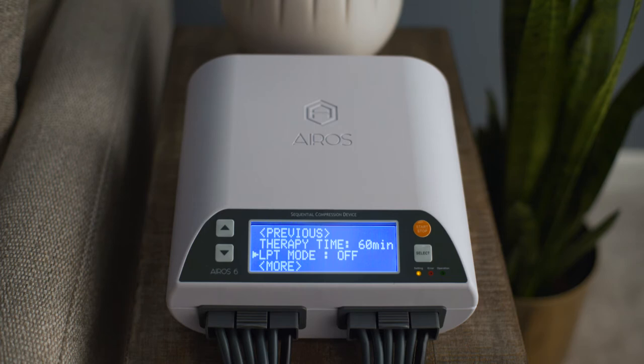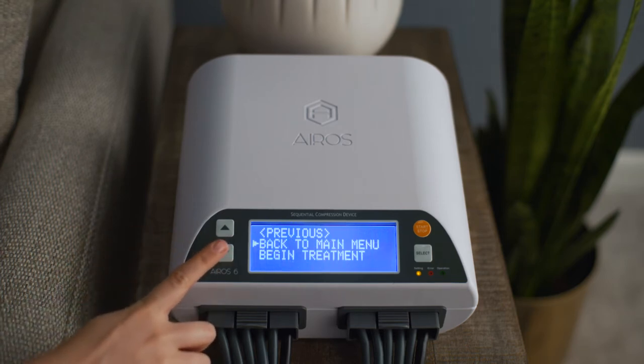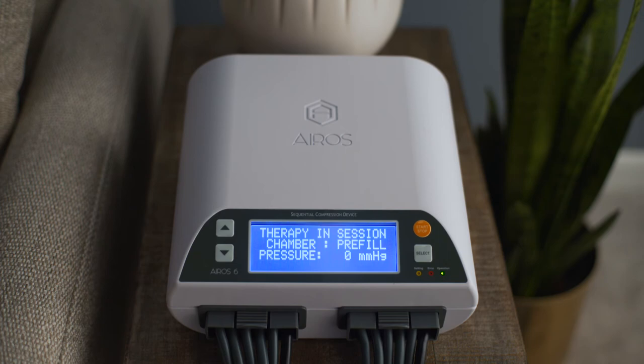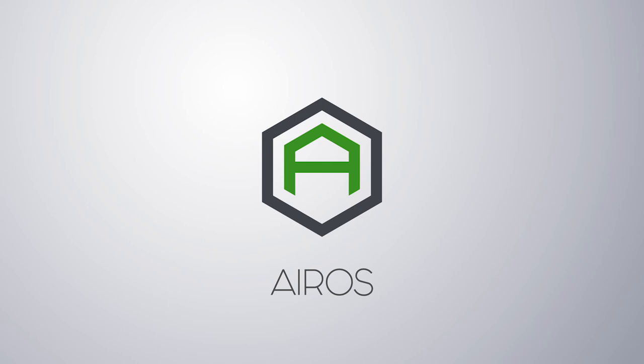To return to the main menu screen, scroll to Back to Main Menu and press the Select button. To begin treatment using the set operating parameters, scroll to Begin Treatment and press the Select button. Thank you for your interest in AIROS and our medical technology. More instructional videos related to our device lines are available at www.airosmedical.com.